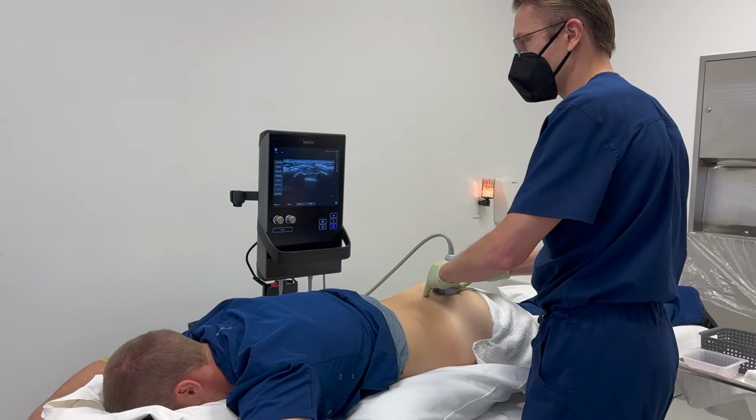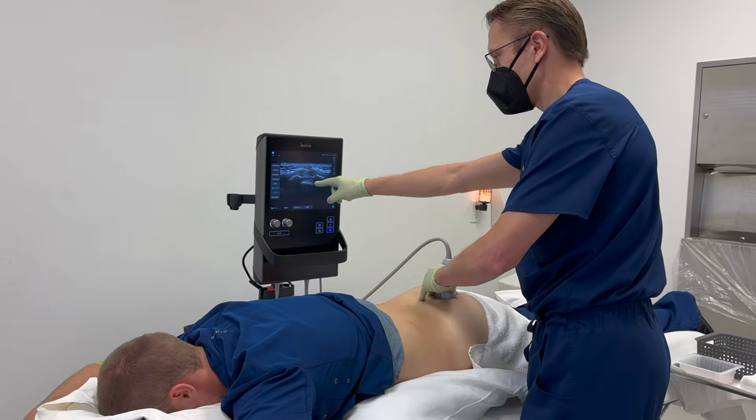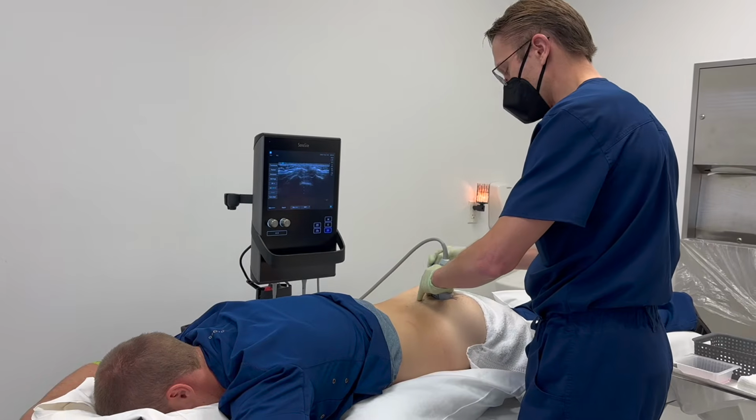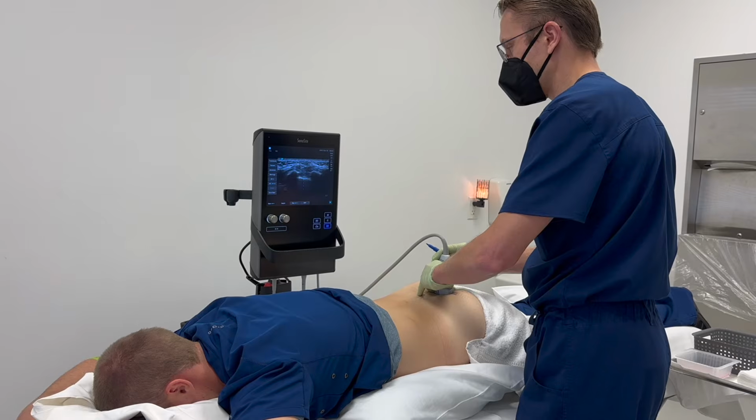First, I'm going to identify the entry point with the ultrasound on his sacrum. Here's going to be my entry point right there. That's where we're going to numb up the area, and that's where we're going to put the injection in to spread the platelet lysate into his spine.